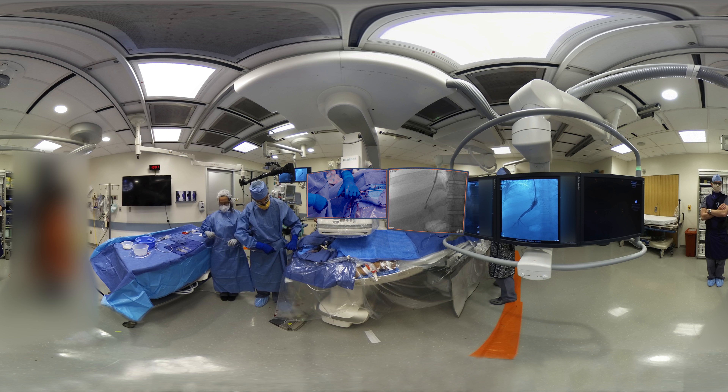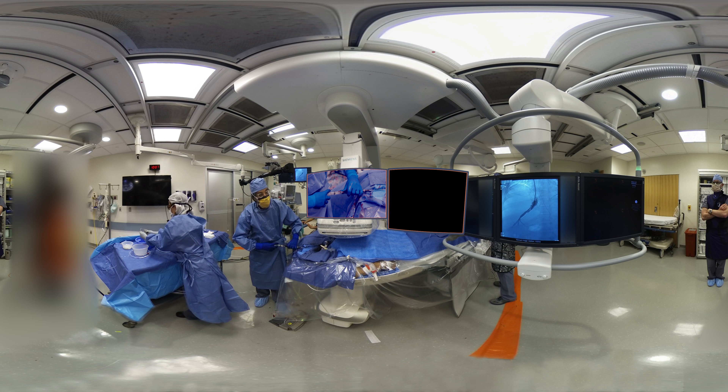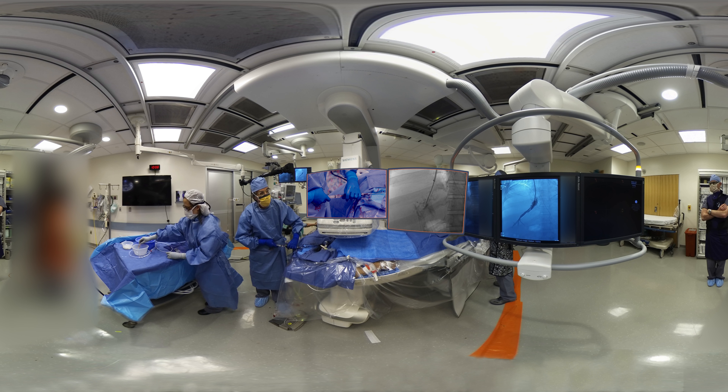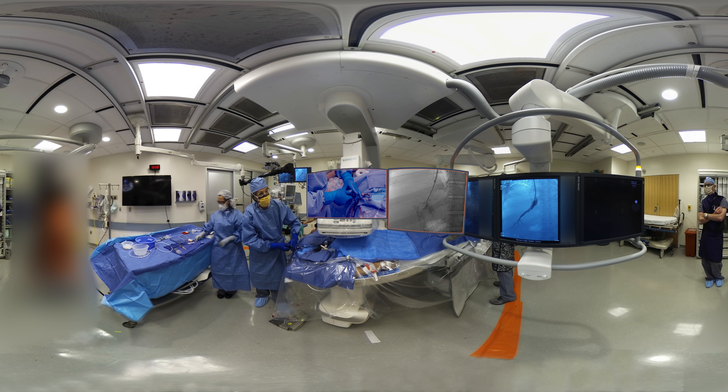I'll take a clean syringe — which is why we half filled them. We are still getting blood return, which is notable. So we're going to inject again. There's a little space there that isn't necessarily clearly vein — some of it is my making. There's even a little bit of a suggestion of a cast of what might be the outside of the portal vein, but I don't see a direct entry. I see some periportal collaterals, I think. So I'm going to draw back a little bit, redirect, and start a new pass.